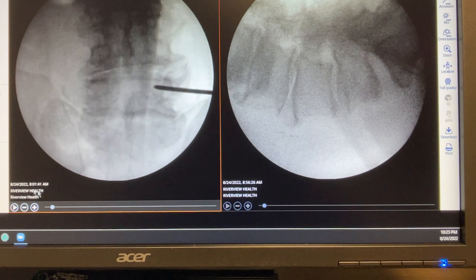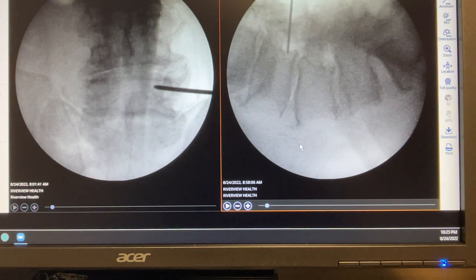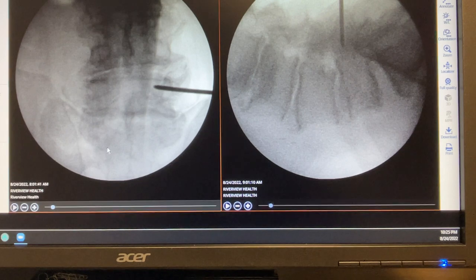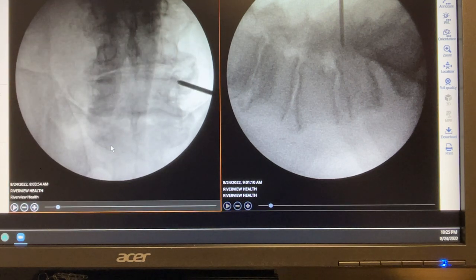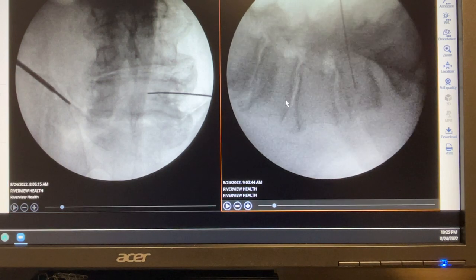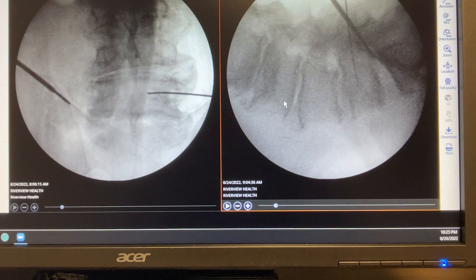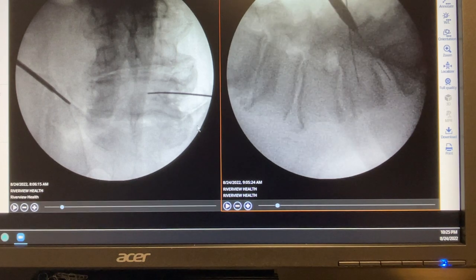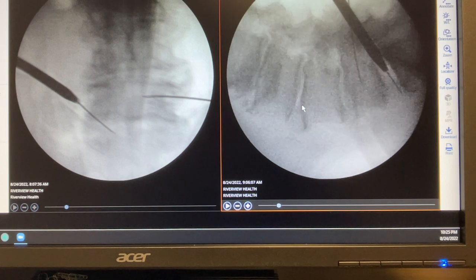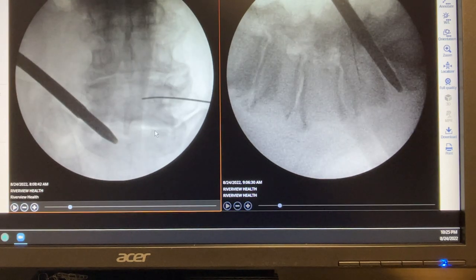Surgery starts at 8:56, or 8:59 when we put the first graft sheet in. Then we mix the bone marrow with the tricalcium phosphate after placing the graft sheet. I then go with the probe to the Kambin's triangle, enter the K-wire dilator, and perform a discectomy.